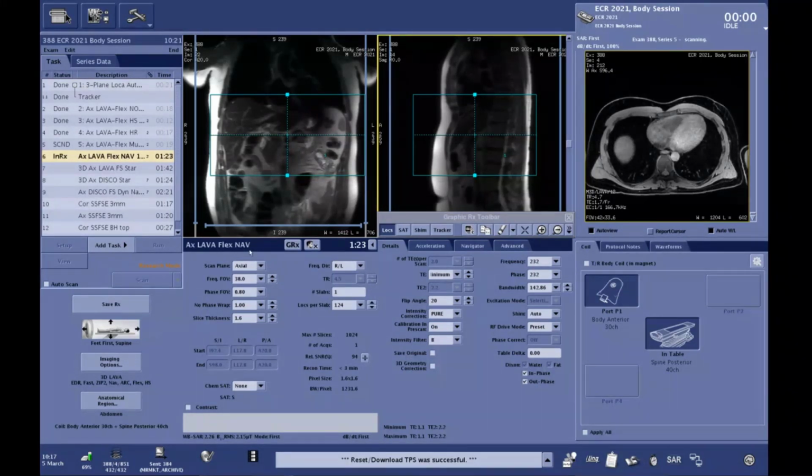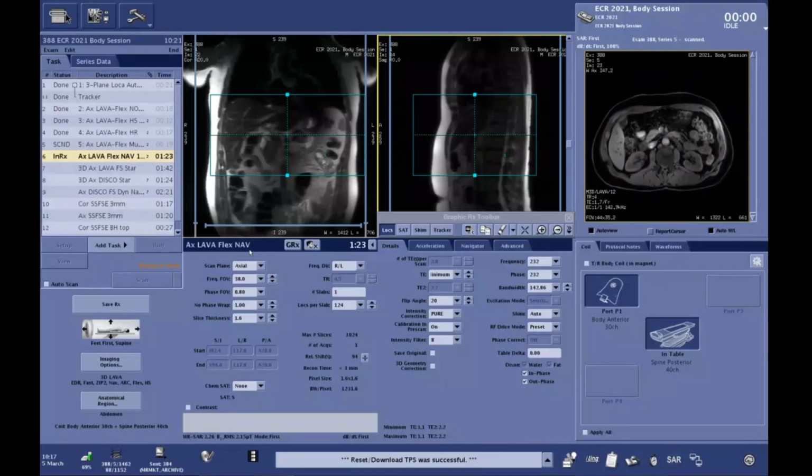The last one, so here, I think we are okay with the breathhold. Maybe at this time of the examination, I have a patient that cannot hold his breath anymore. So starting from that, let's discover how it's possible to manage that.